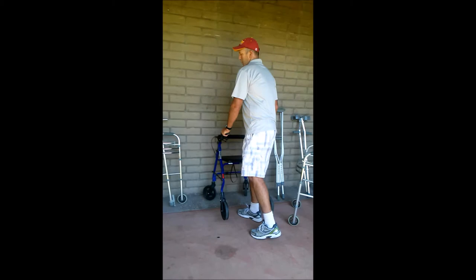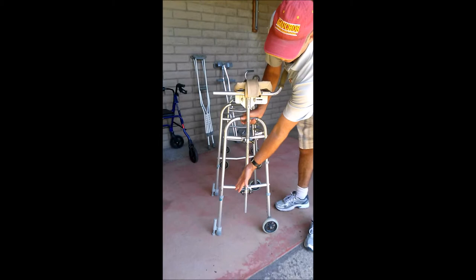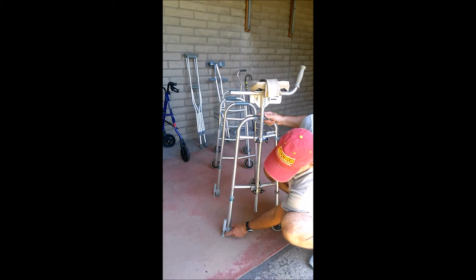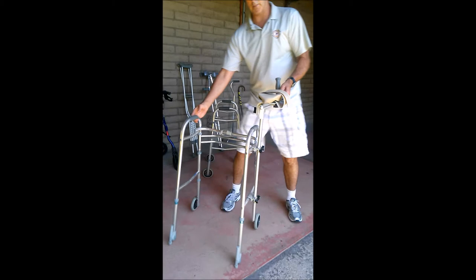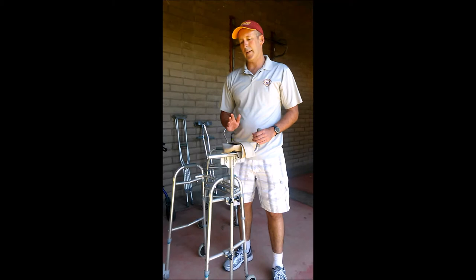Here we have a true front wheel walker - you see the wheels on the front and a stability pad on the back. Some folks use tennis balls or a cup that slides, but this one is designed for more stability - it has a rubber surface and a little brake that engages when you stop. You also see a big difference with this one: there's an upper extremity support, or arm trough, turned on the right-hand side.